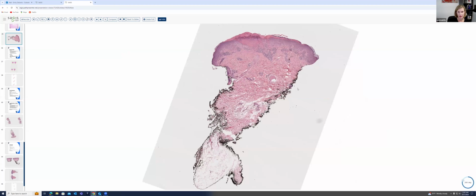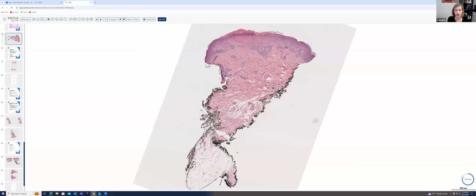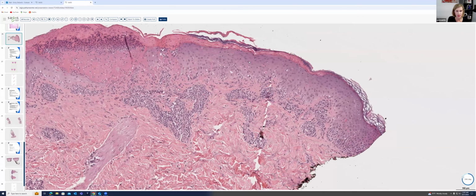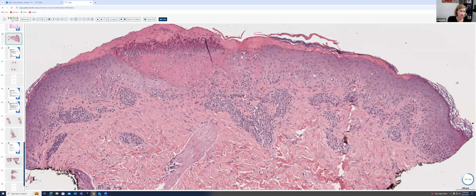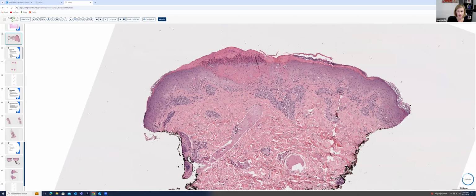This is another biopsy, punch biopsy, where in the center we have this focus of erosion and then an intact adjacent epidermis. So low power, the erosion really stands out. There's some overlying crust and a superficial perivascular infiltrate. And again, when we go higher, while we do show this erosion, we also want to be sure to look adjacent to the area of erosion so we can see what's happening in the intact epidermis. As we zoom in, we see, in fact, numerous individual dyskeratotic or apoptotic cells at all levels of the epidermis. So another example of erythema multiforme. In this case, it's an ulcerated or excoriated lesion. We don't see any viral cytopathic effect, but the differential would be infection versus medication induced.